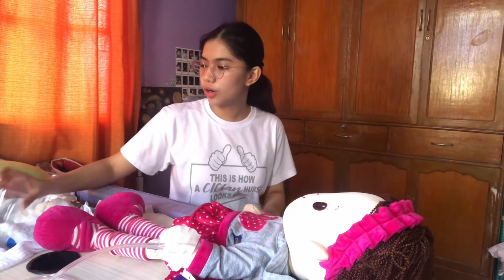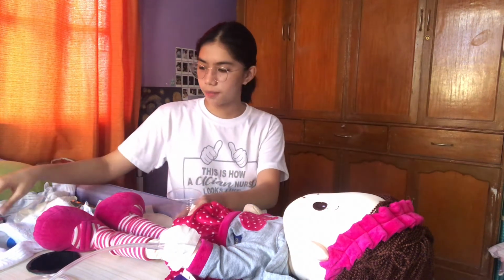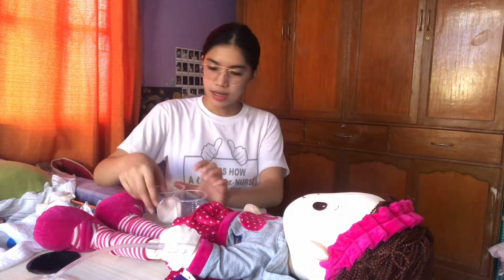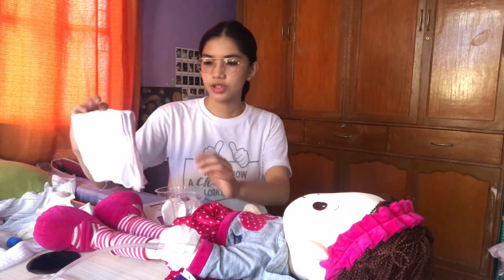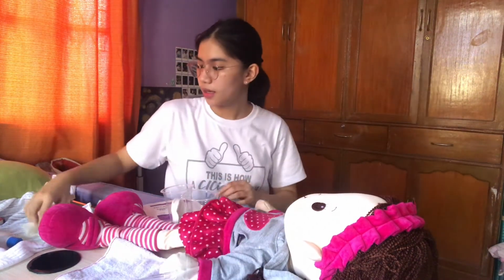And I'm just gonna open all the equipment, the swab, dressing, adhesive bandage, and I will put a towel under the extremities. And I will apply clean gloves.